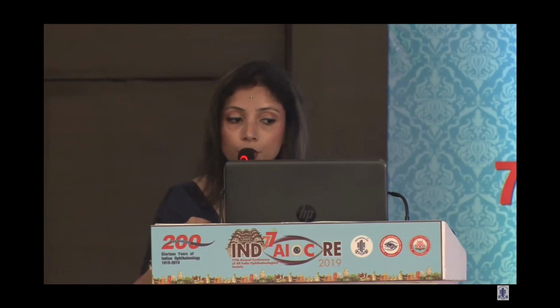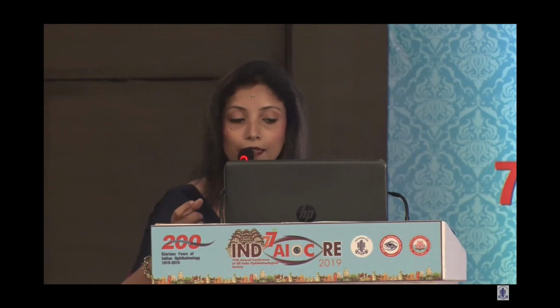The sharp instrument tips are covered with silicone plugs and then kept as a set in stainless steel trays. After that is done, it is packed. The packing is separate for steam autoclave and for ethylene oxide. For steam autoclave, the packing is with double layered linen, and on each layer the chemical indicator strip is attached and the date and time is written on that. For ethylene oxide, the packing is separate, with indicators which change color after the sterilization process.